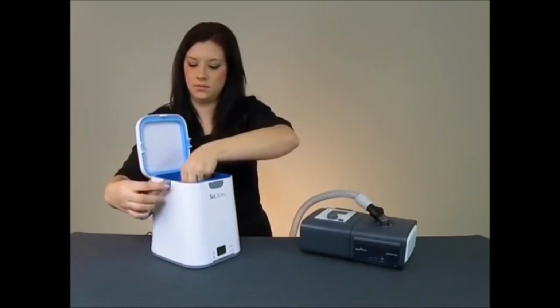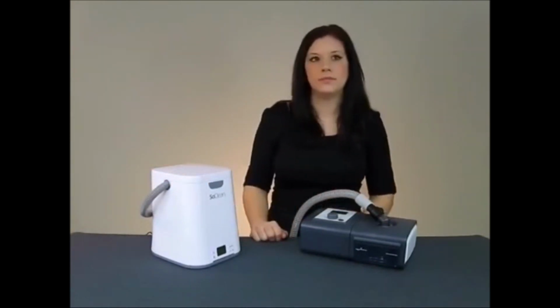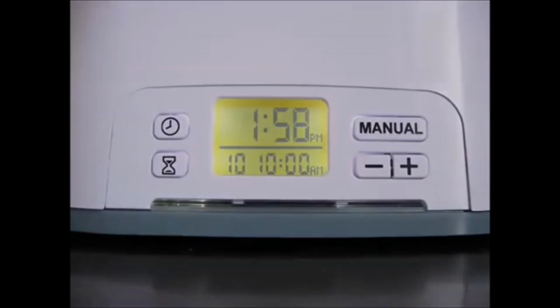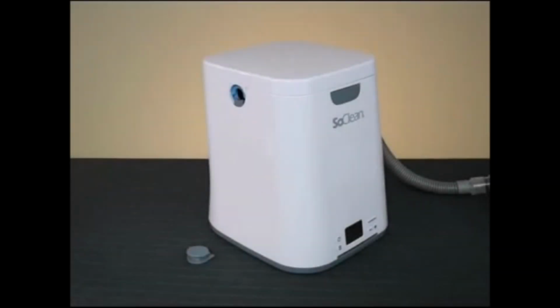Now, with your mask and hose in position, close the lid firmly, allowing it to snap shut. The SoClean will now operate according to its preset time and duration. Please note, the SoClean will never operate without the mask and hose present in the securely closed chamber. Neither will it operate if the hose slot plug is missing or improperly positioned.